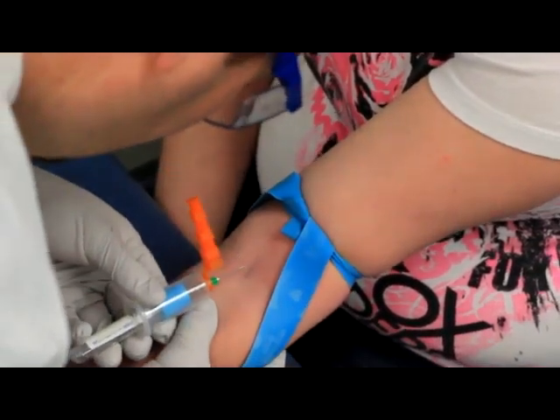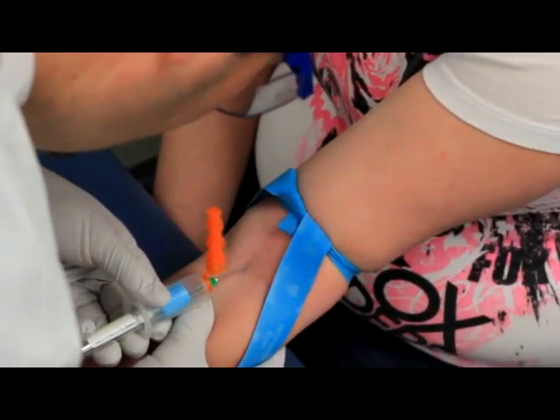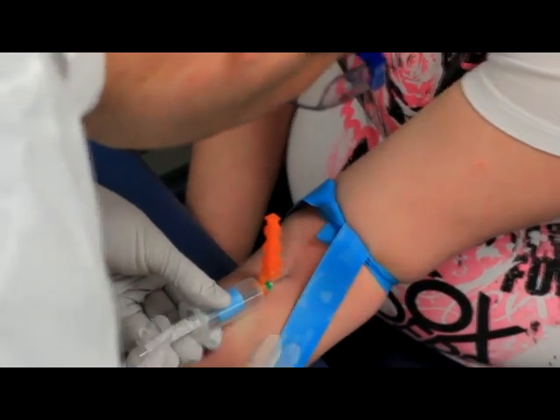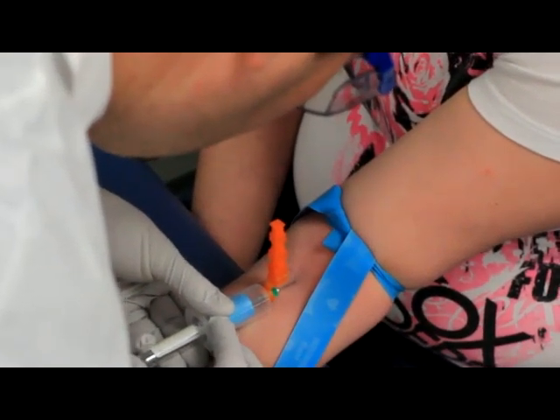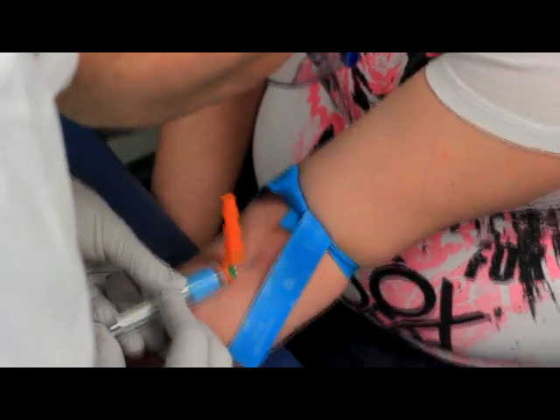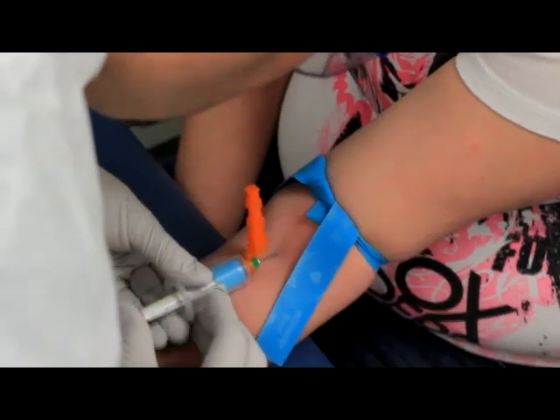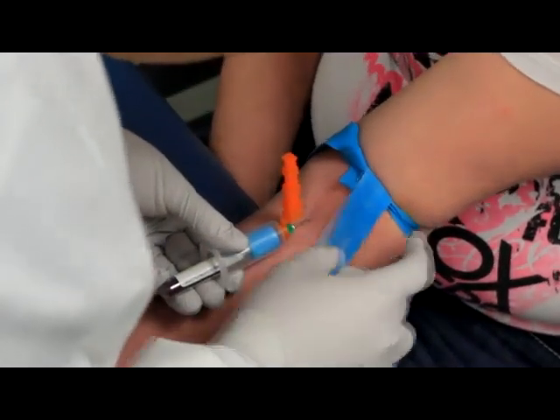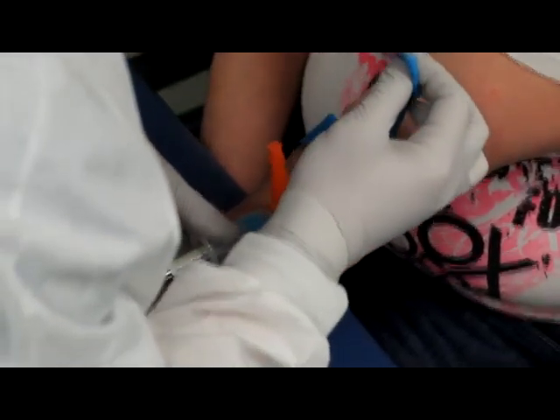Firmly anchor the patient's skin with the thumb of your non-dominant hand to prevent the vein from rolling and for the patient's comfort as the needle is inserted. Once you believe you have the needle positioned inside the vein, release the anchor. Firmly plant the hand holding the needle on the patient's arm for stability, and use your non-dominant hand to push the evacuated tube onto the needle. If successful, blood will be pulled into the tube via vacuum to the level determined by the manufacturer.